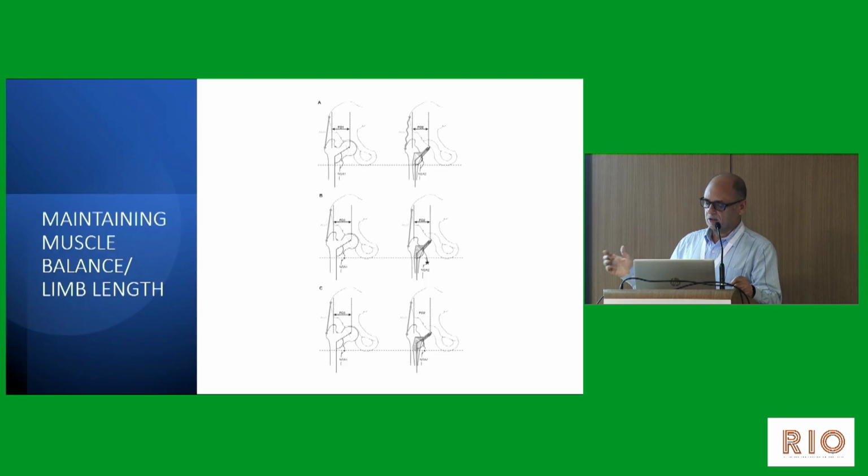So strengthening, again, if your gluteus muscle is lax or tight, that can give you a functional feeling of a functional limb length discrepancy. So in such cases, modularity becomes very important. You need to always tell your company fellow to provide other offsets and neck lengths. So use those implants where you have the possibility of increasing and decreasing the offset. I think that's all. Thank you.